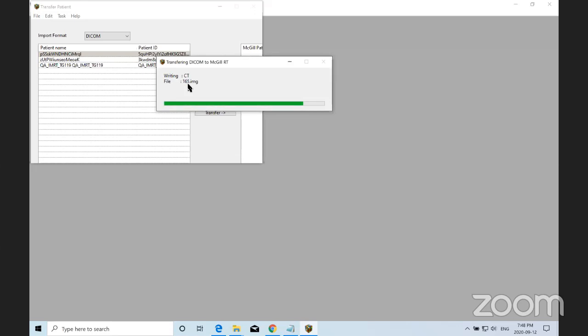One of the things about that, Wameed, is you can change where you're calculating over the region of interest. So you may not want to calculate over the whole data set, and you can narrow it into the area of concern. Okay, that's with MMCTP? Yes. Oh, I did not know that feature. I'll show you once we get to that point, hopefully, of running a patient calculation, where the user can select the borders for the superior-inferior direction.